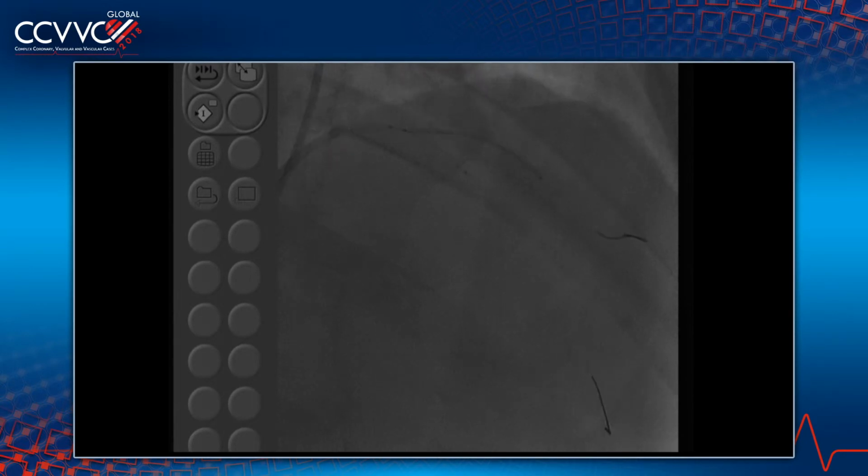And it is slightly short for this. So deploying the stent and then the balloon. 12. Oh, perfect. Nice. So this is a 25-32, 2 millimeters sticking in the main vessel.